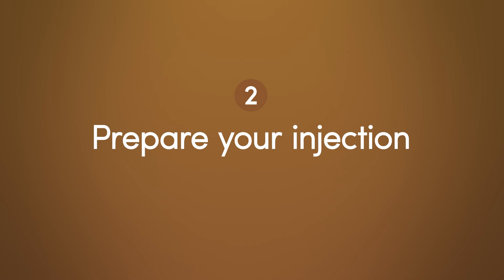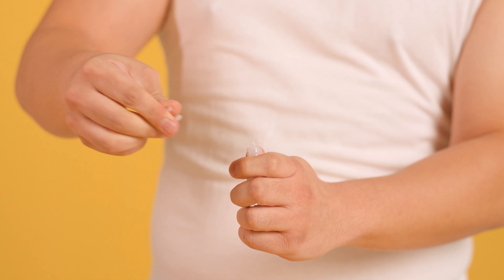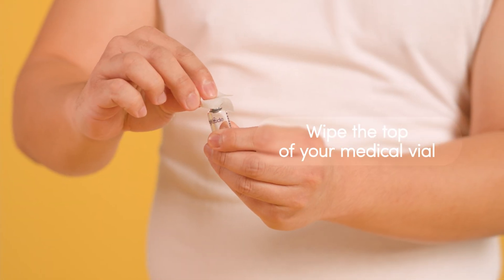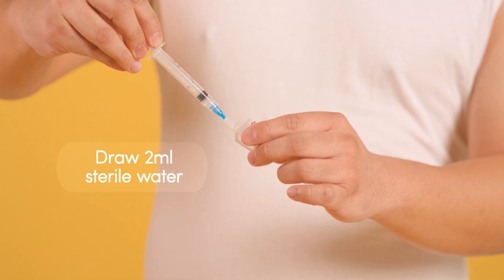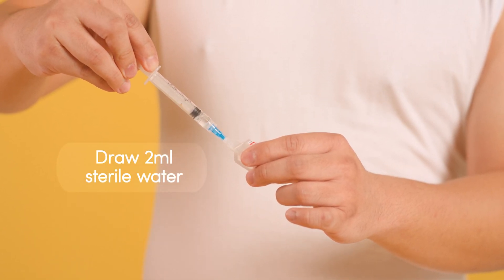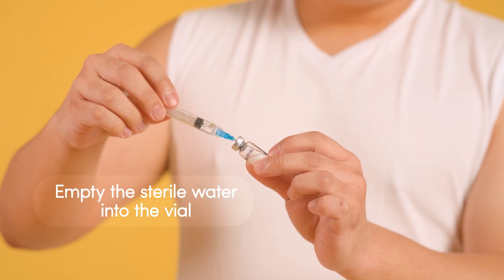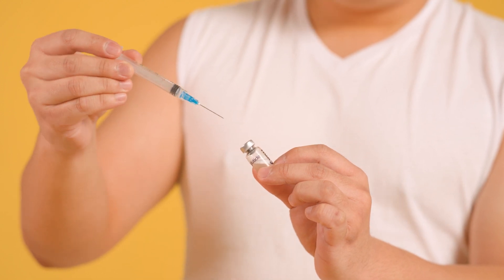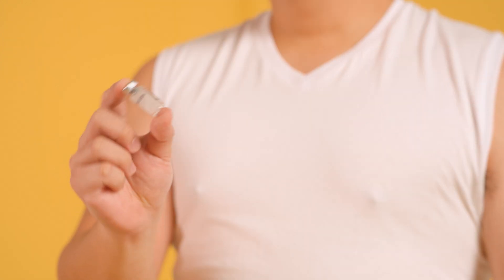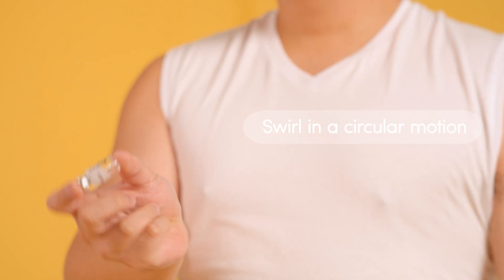Next, prepare your injection. Remove the protective cap from your semaglutide vial and uncap your sterile water. Using the alcohol pad, clean the top of the semaglutide vial. Using the big syringe, draw 2ml of sterile water and insert the needle into the rubber cap of the semaglutide vial to empty the sterile water. Pull the needle out of the vial and discard. Gently swirl the solution in a circular motion until the semaglutide powder and sterile water completely combine. Do not shake the solution.